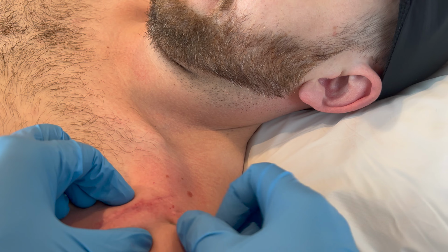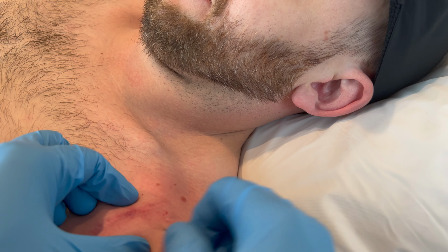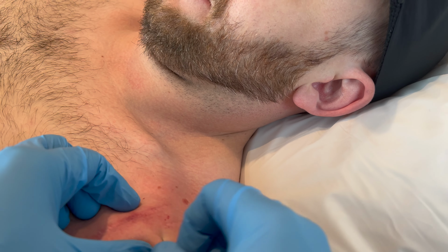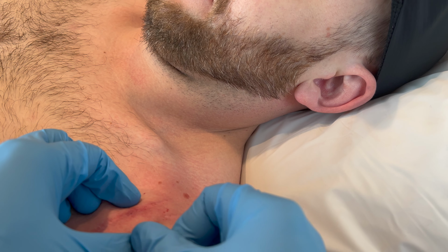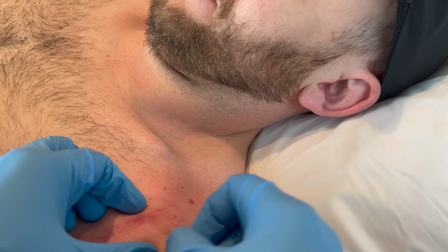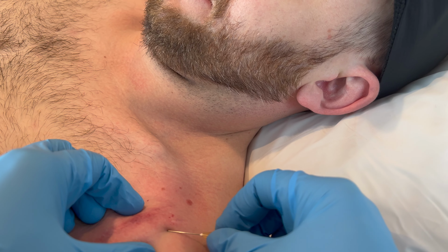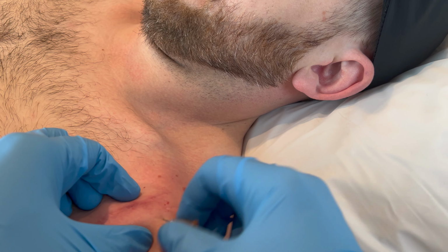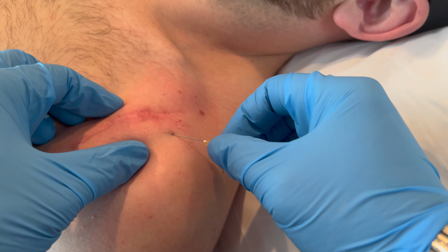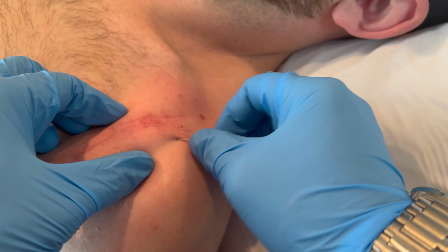As I wiggle the needle left and right, I'm trying to disassociate some tissues underneath. And now go to a different angle. Now retrieve and continue, and withdraw again. Go forward. Now go in a different direction. There's a trigger point here, I can see. There, you can see a twitch.